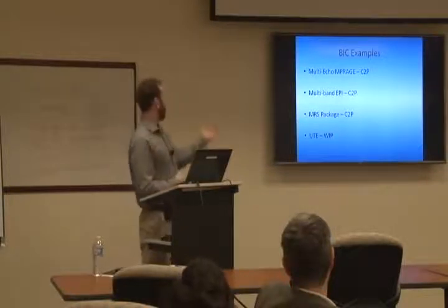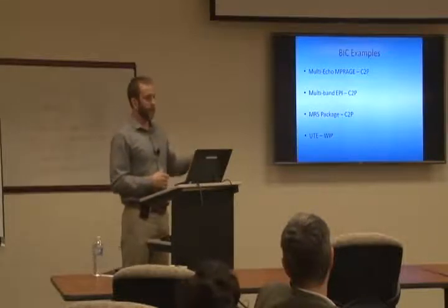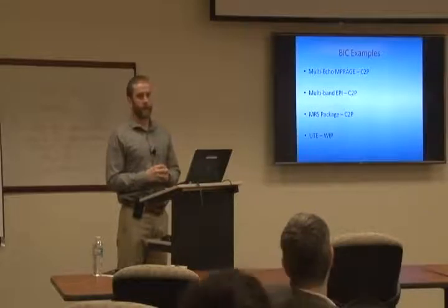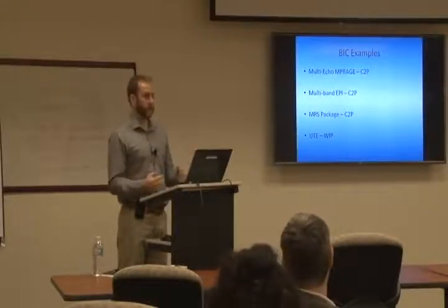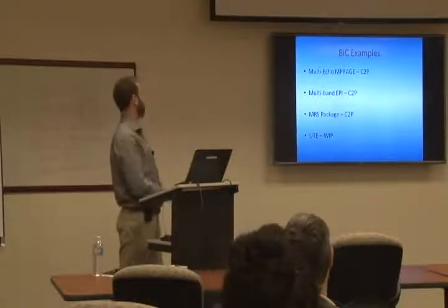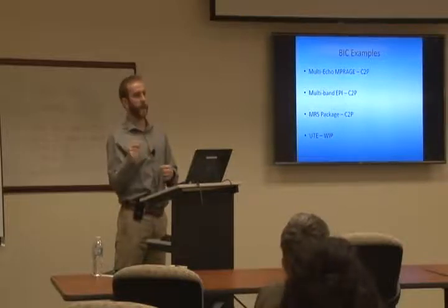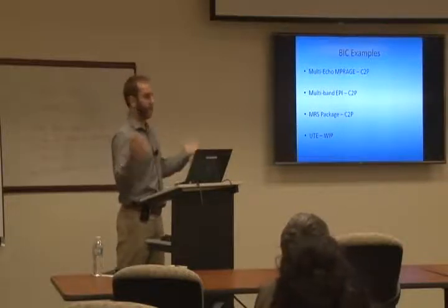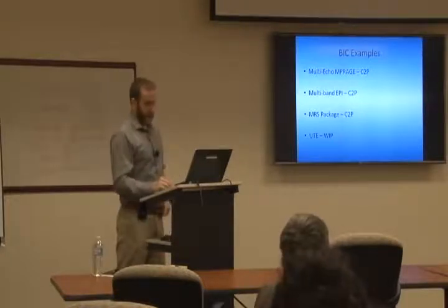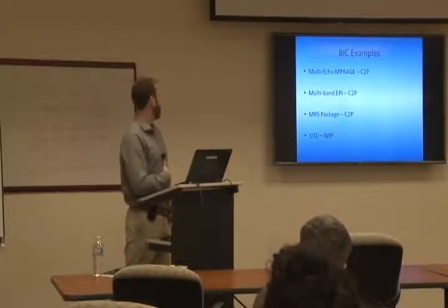Another one is the MRS package, again through C2P. Both of these were through Minnesota. It's kind of what I showed you earlier. You get far superior data than what's available on the system with the basic PRESS and STEAM sequences. And this one, honestly, they get so many requests for this that it's as easy as going to their website, downloading the C2P, signing it, and sending it back. And then you get all these state-of-the-art sequences. So very, very easy to get these sometimes. Sometimes it's a little harder than others.